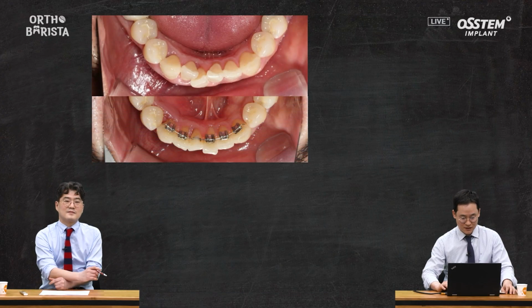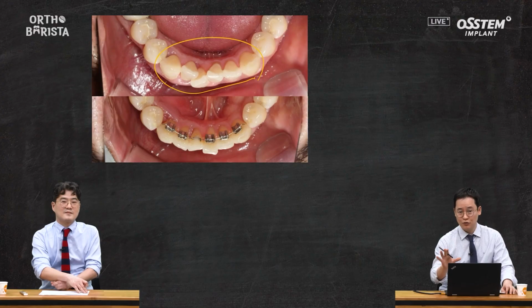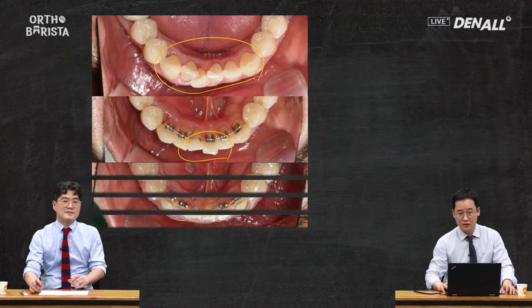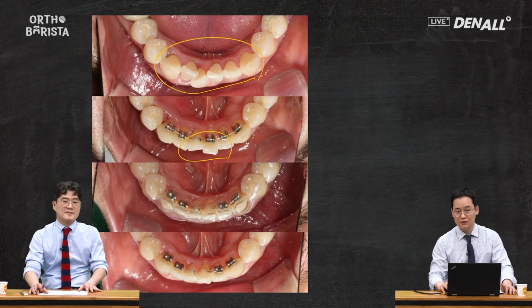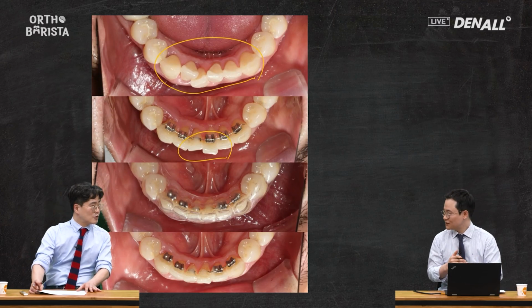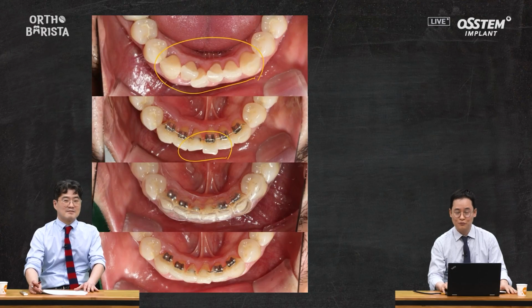This is an example of a case where both partial orthodontics and clear aligners could have been used. However, the patient opted for partial orthodontic treatment. While using partial orthodontics, differences in alignment between the front and back teeth can arise. In such cases, clear aligners can be employed to adjust these discrepancies effectively. That's why I use a collaborative or dual approach. Combining methods can be a very effective solution. This is definitely something worth considering.